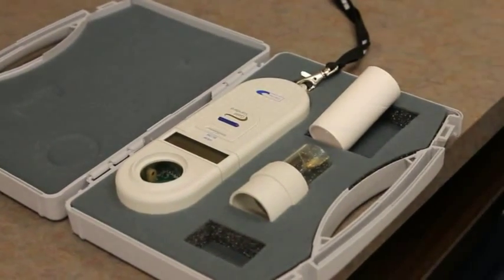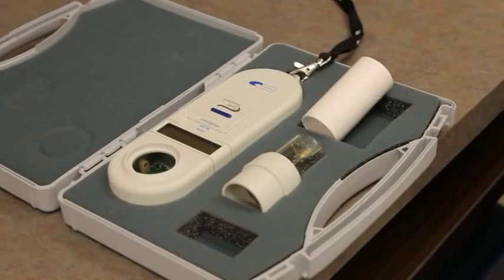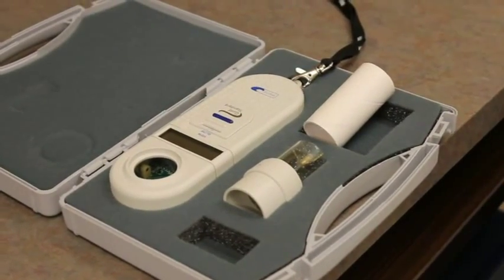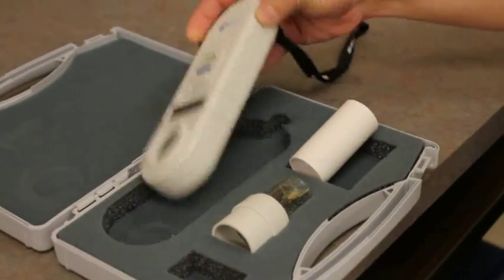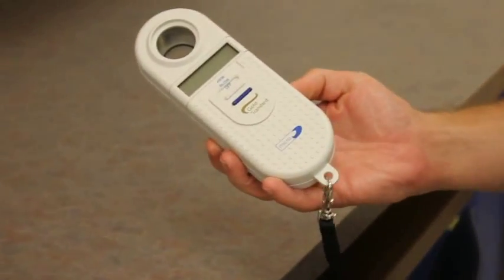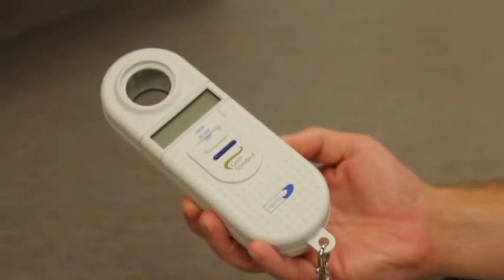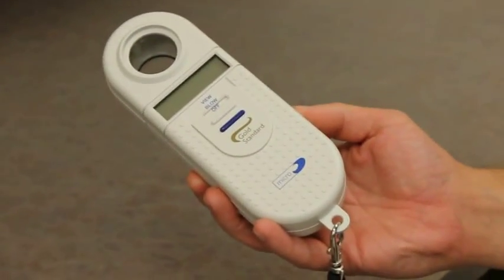Okay, so for the next lab assessment we'll be doing a pulmonary function test. This is a portable microspirometer and what it does is it measures the amount of air you can blow out after a maximum inhalation, so after maximal inhalation, maximal expiration.